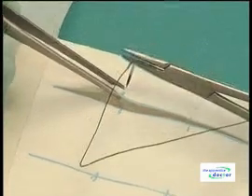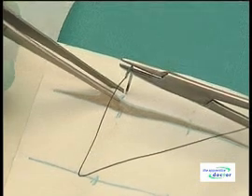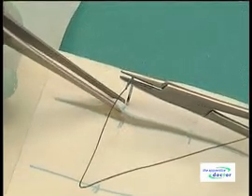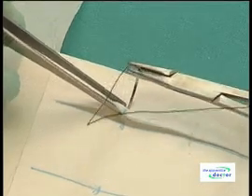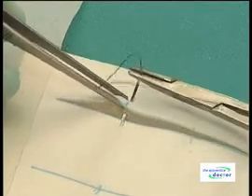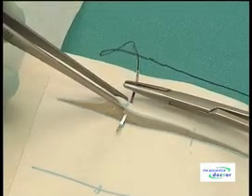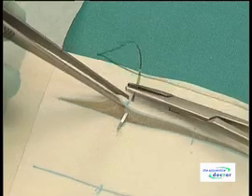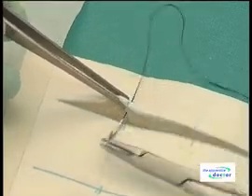Let the needle penetrate the surface of the imitation skin on the far side, approximately three millimeters from the margin of the incision, at an angle of ninety degrees to the surface of the skin. Let the needle penetrate both the epithelium and the dermis.